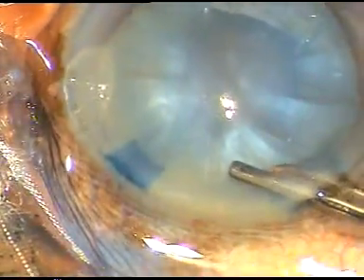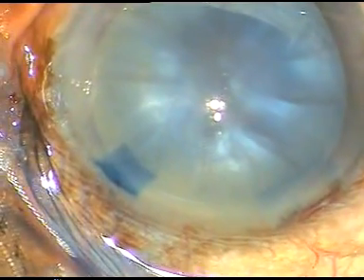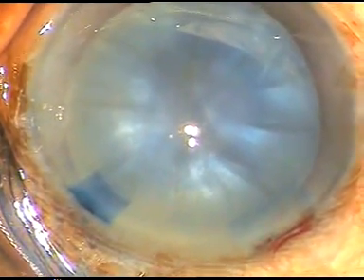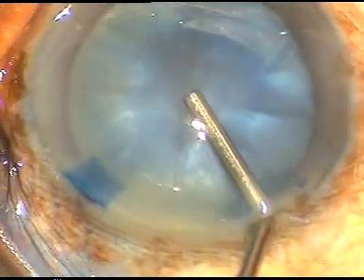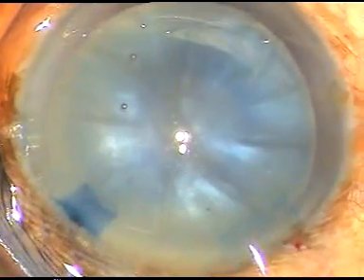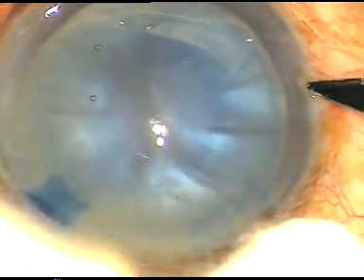Now in intumescent cataracts I use HPMC as the viscoelastic substance. I do not use sodium hyaluronate. So this is HPMC. Now I have to make another side port on the right side of the main incision. Here it is.